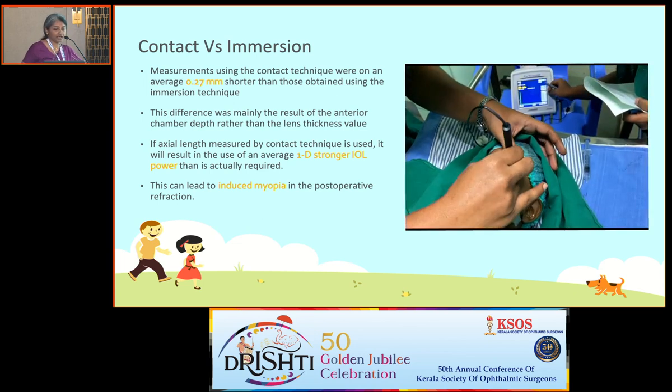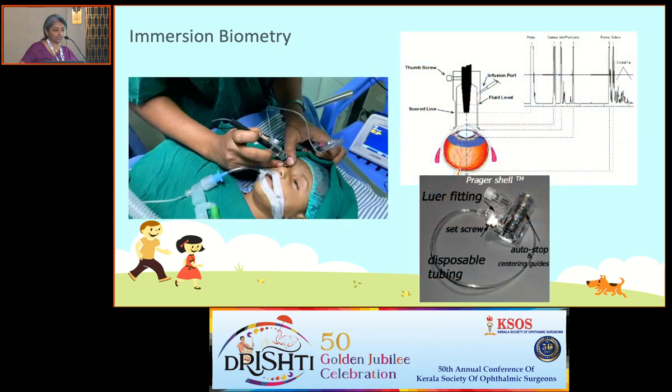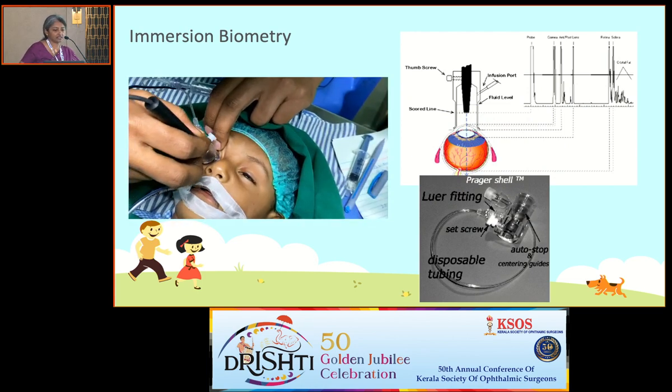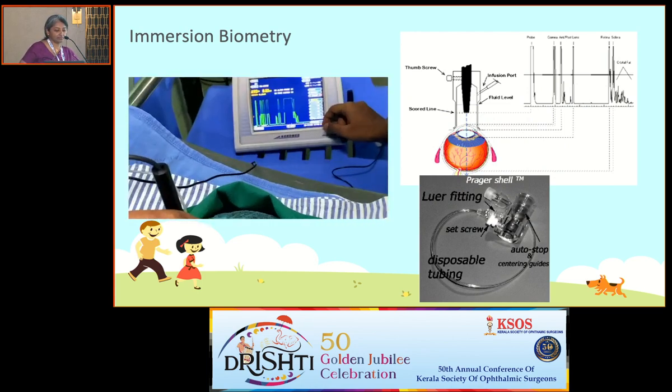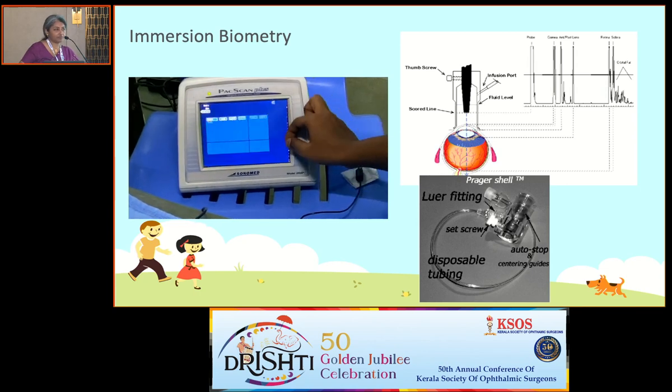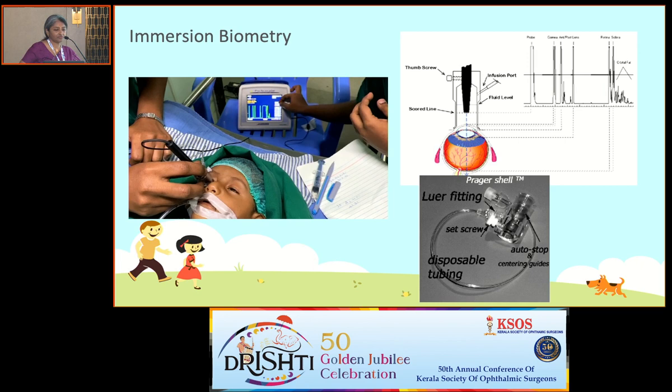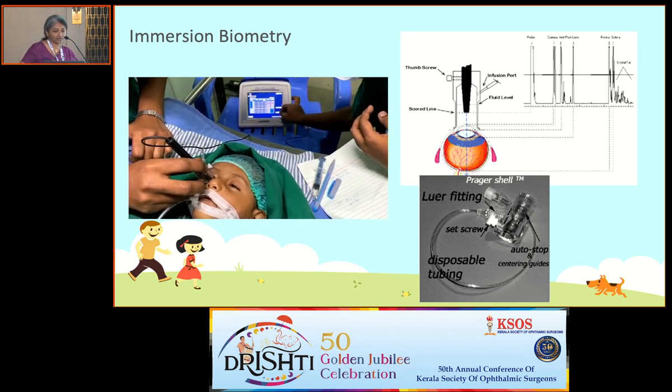There should not be any eyelid speculum, and it should be just after the induction. And if you are using the contact technique, you should be really sure, because a small compression can result in a huge error. So now we have moved to immersion. We no longer do the contact biometry in small children. The only thing is, sometimes in very small children, the immersion cup doesn't fit very well. So in that rare situation, we use the contact method.